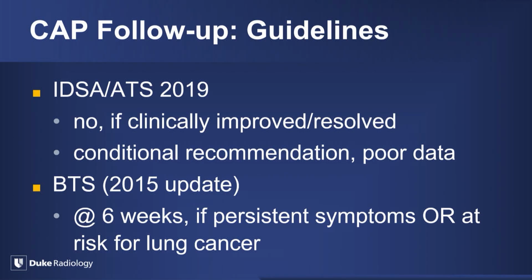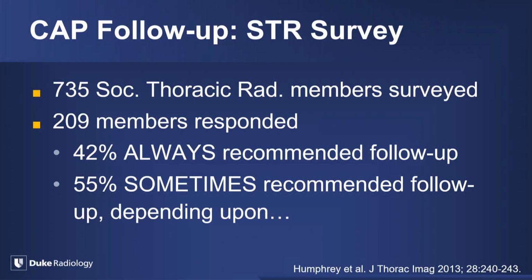When you're thinking about how you dictate the case when you see the first film, right? You don't really know necessarily what the risk factors are. You don't know if the patient's symptoms are going to resolve and that sort of thing. And that makes it difficult for us, I think, in knowing what to do on that initial radiograph.